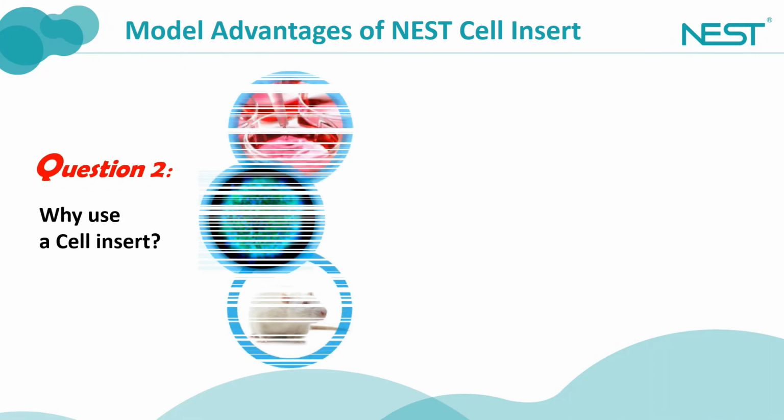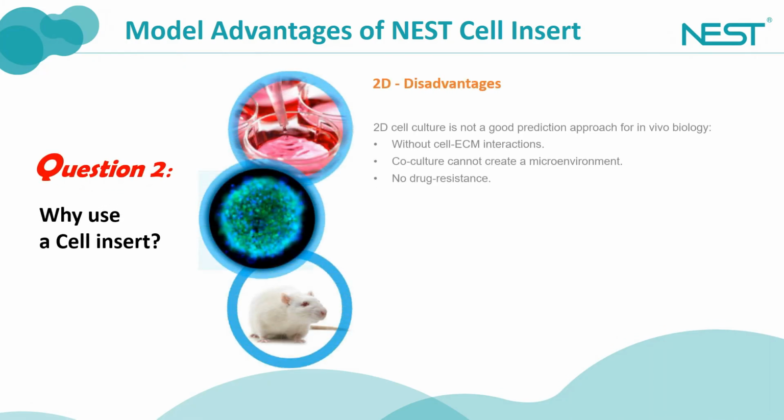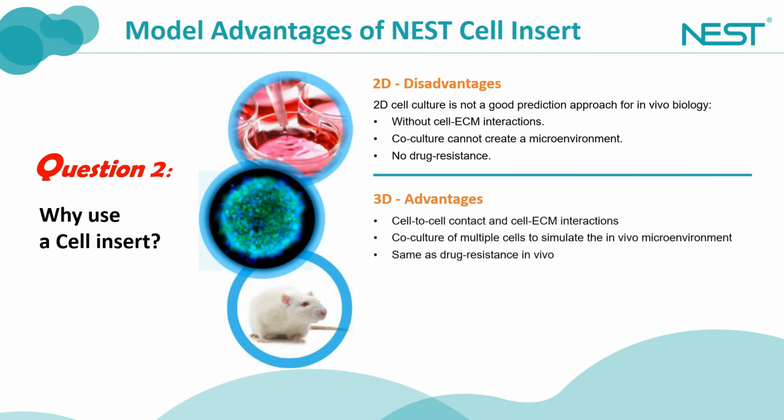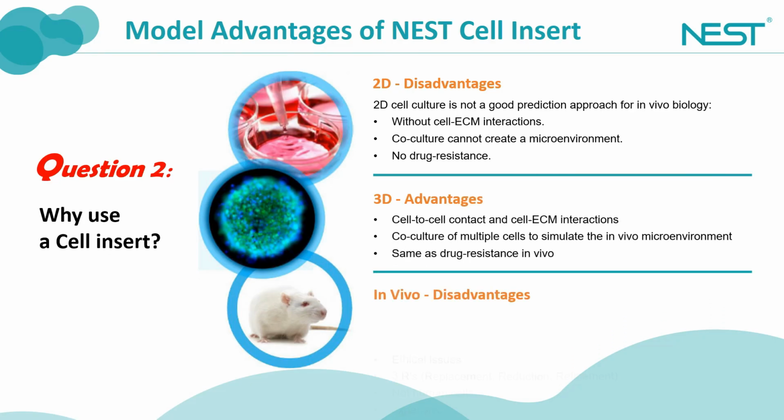Firstly, the cells inoculated in the upper chamber grow on the microporous membrane, so they can intake nutrients from below through the pores of the microporous membrane. This way of obtaining nutrients is the same as the way cells get nutrients in vivo, which is different from 2D culture. 2D culture refers to the culture on the general TC-treated surface.